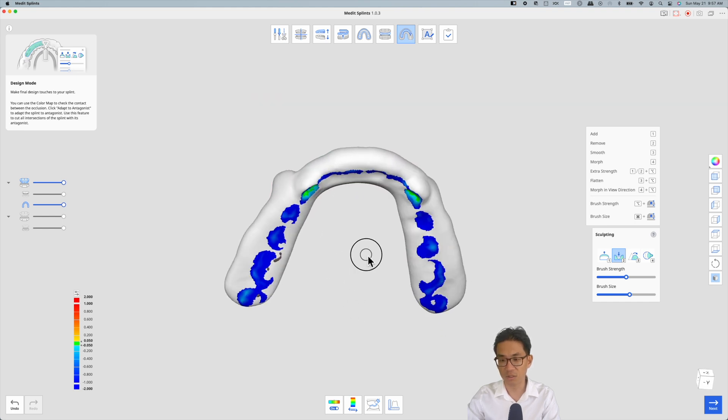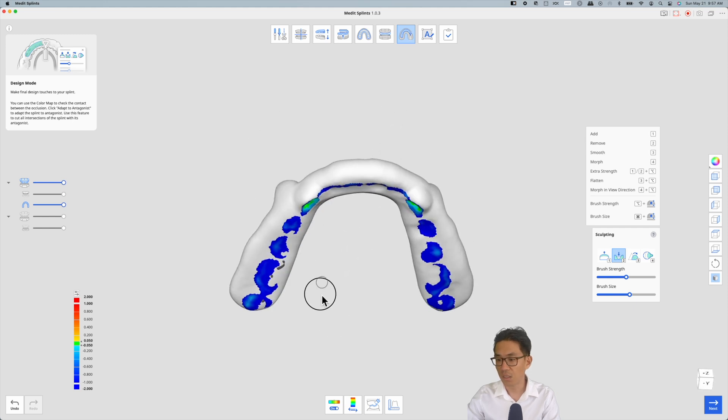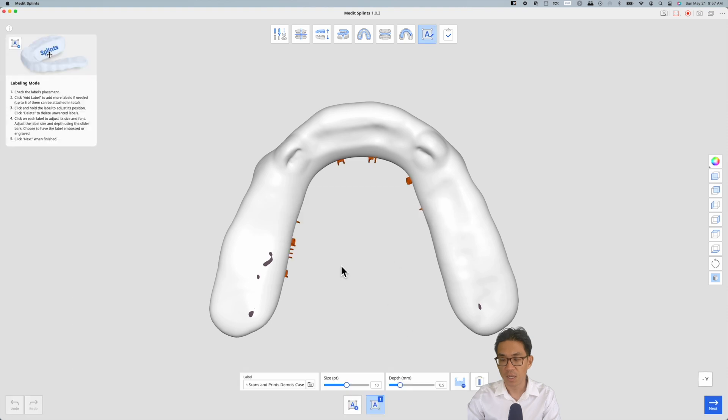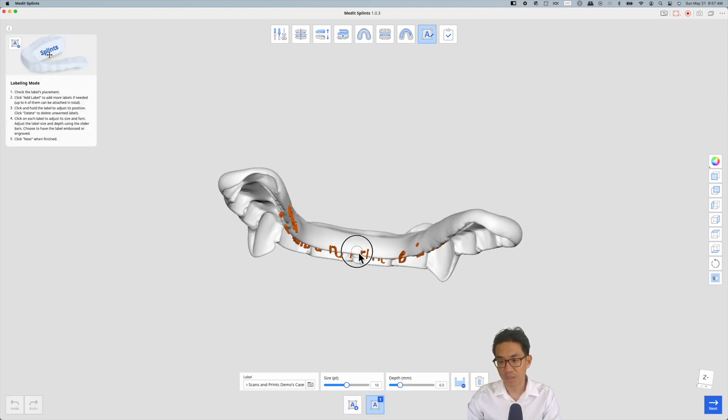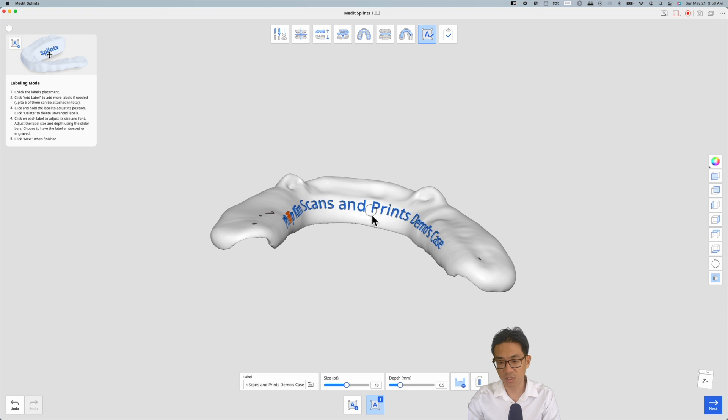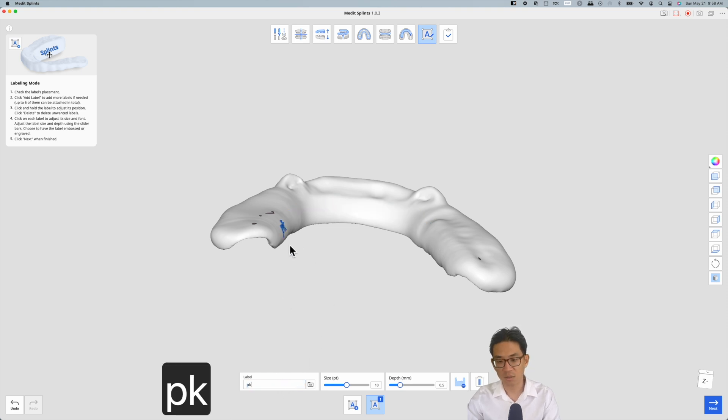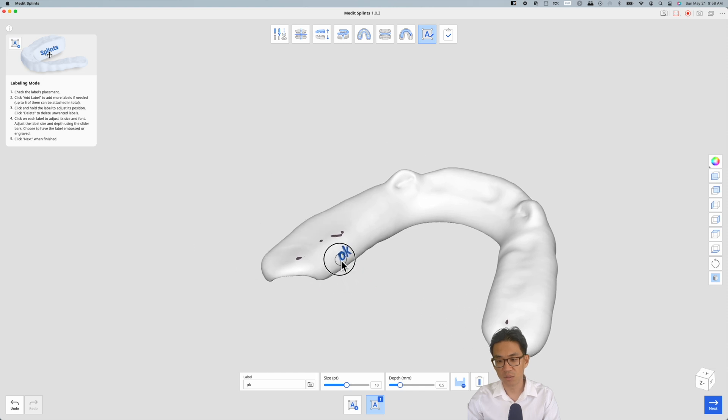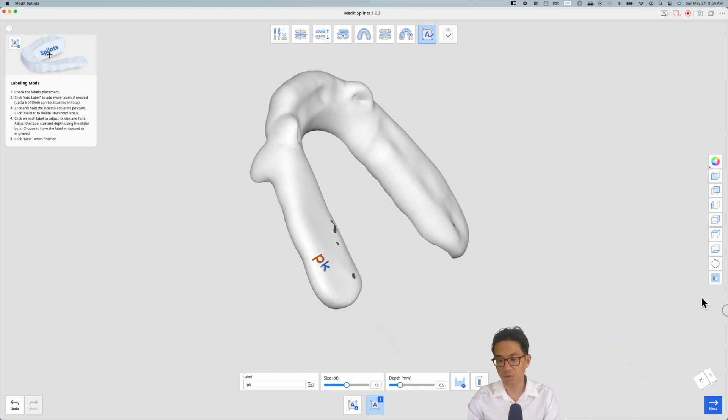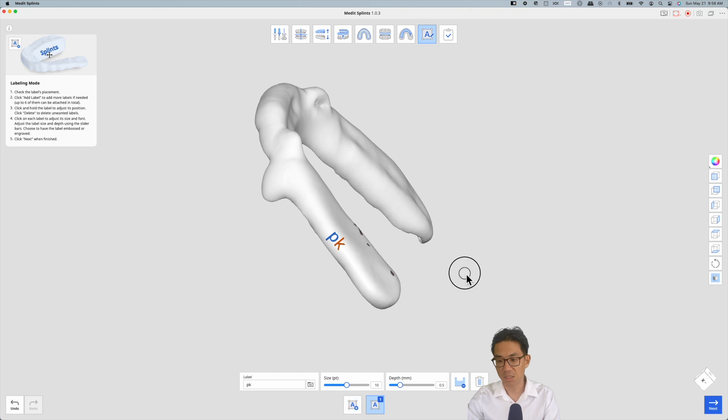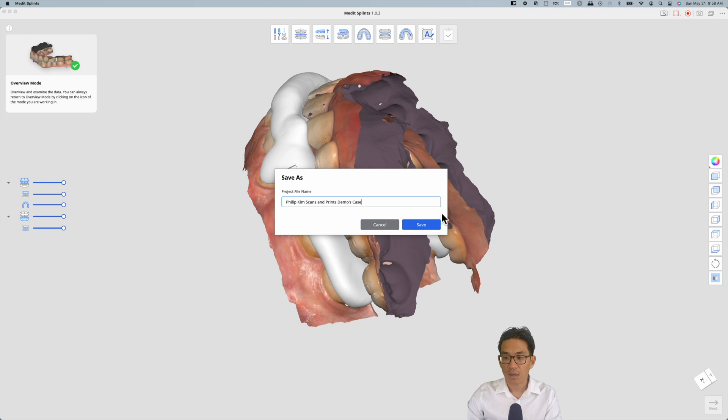Just hit next and then you have the option to add a label to your night guard, which I don't think a lot of people do. However, it's nice that they offer this functionality. Obviously don't want it on the tongue side, it would be quite annoying for the patient, so maybe on the cheek. Just make sure the lettering is all in blue otherwise it'll error out.